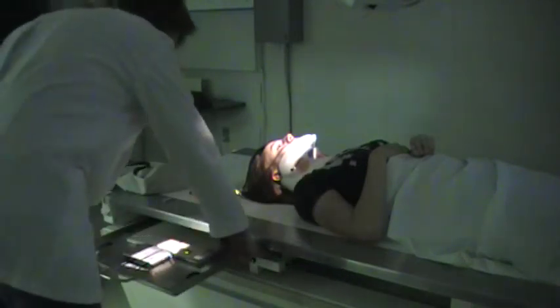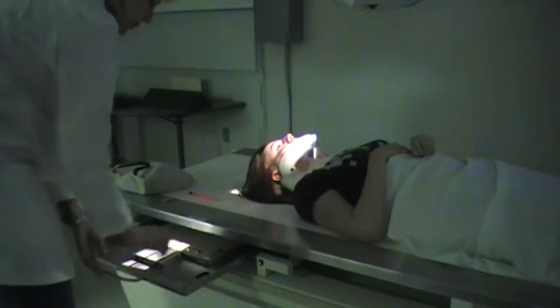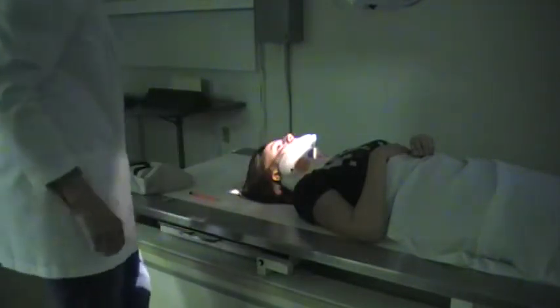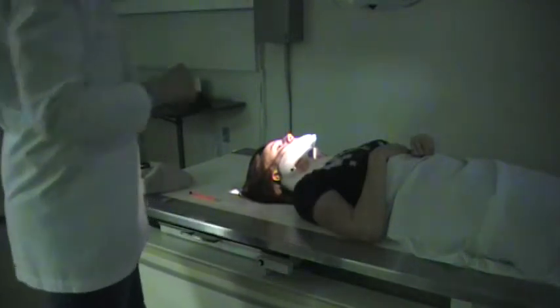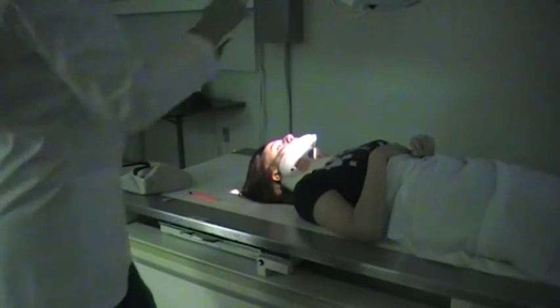Okay, and then just line up your Bucky tray, make sure that it is lined up with the tube. I'm going to place my right marker here to indicate this is the right side of her face. So that is the reverse Waters. Next I'm going to do the reverse Caldwell.